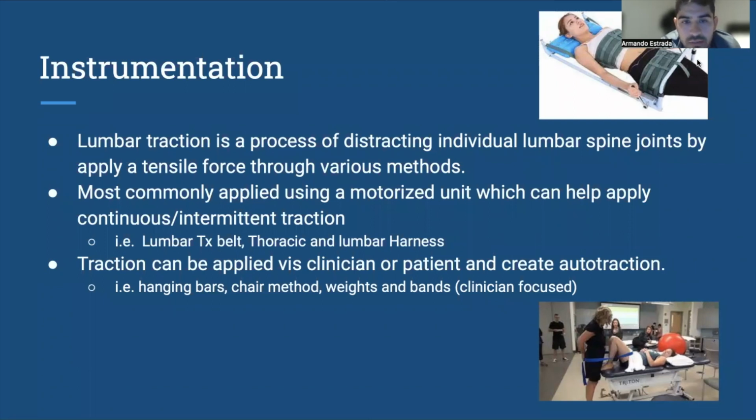Traction can also be applied via the clinician or the patient to create an auto traction. Examples of these would be hanging bars, where the patient could just hang off the bars and apply their own traction. Utilizing chairs, they can also use weights or bands, which are more clinician focused.